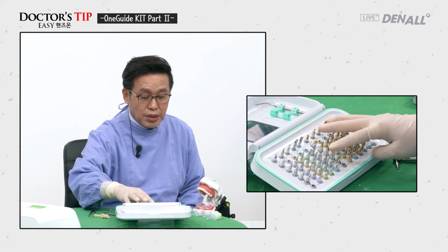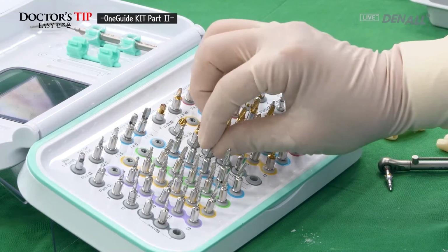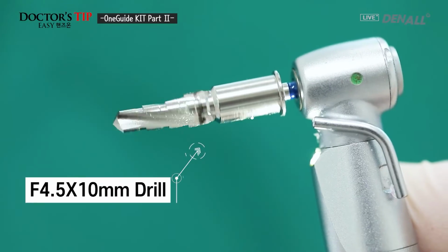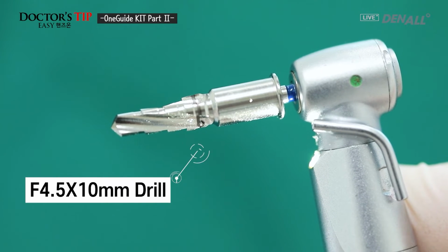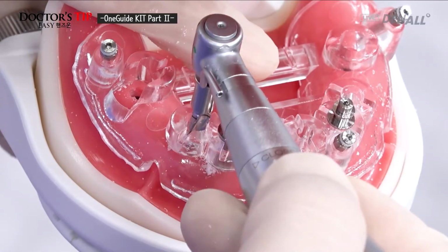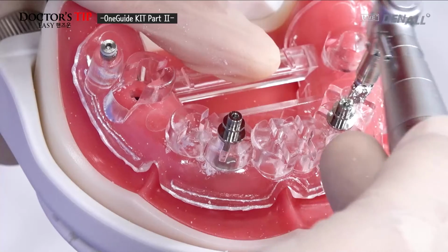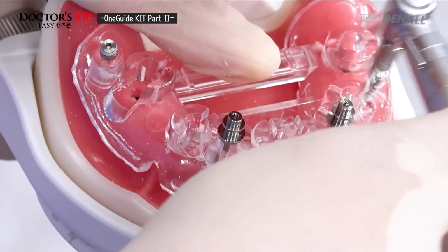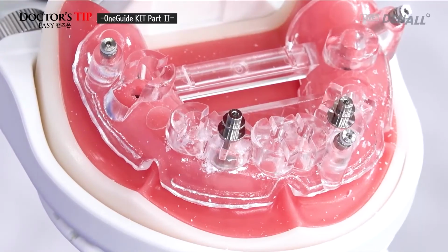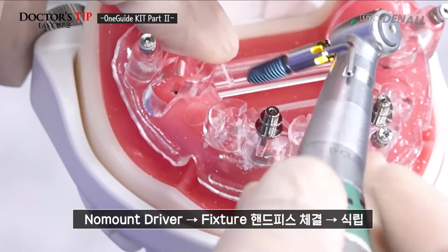4.5 by 10 millimeter implant is going to be placed. So final drill is 4.5 by 10 millimeter one guided drill. And on both sides, final drilling is done. Final drill. Do it the same for this side. 4.5 by 10 millimeter. Check if it is placement mode.